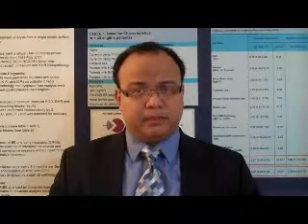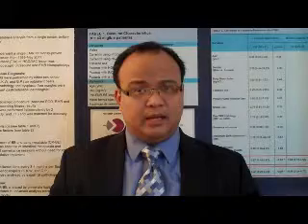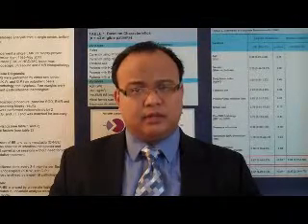We then randomly presented to 3 gastroenterologists 64 probe-based CLE images to be classified using the Miami criteria and 64 stacked endoscope-based CLE images to be classified using the Mainz as well as the fluorescence intensity criteria. Inter-observer agreement and accuracy were determined for dysplasia prediction.